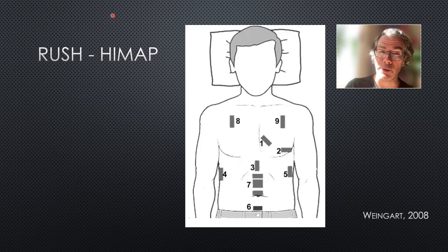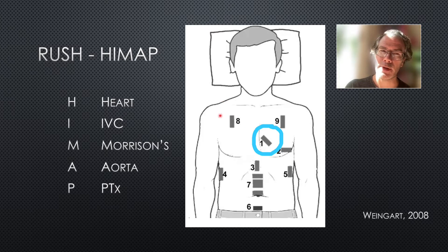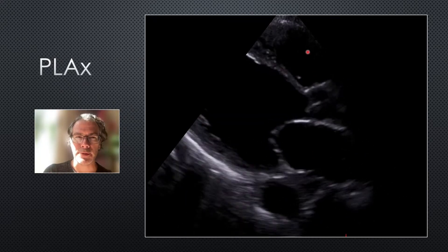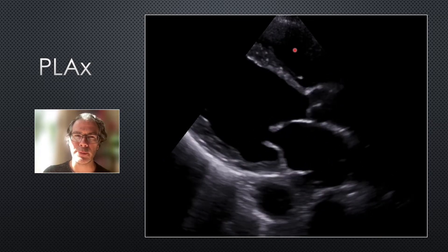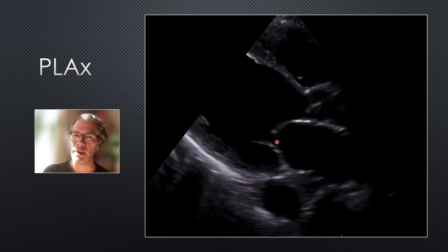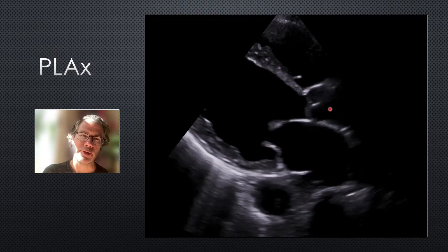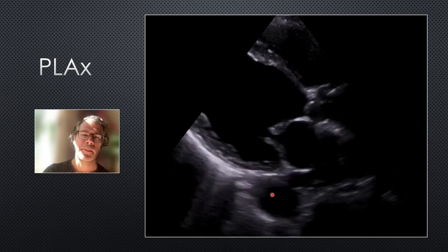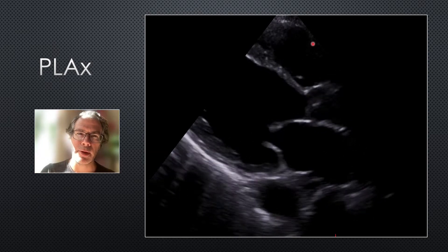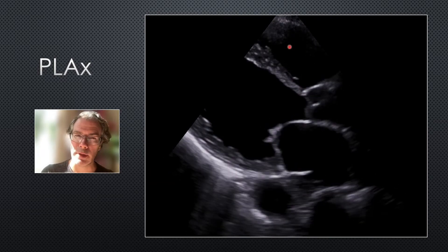We start the HIMAP exam with the heart. The first view is the parasternal long axis view — marker to the patient's right shoulder, probe across the heart in long axis. At the top of the screen closest to the probe we have the right ventricle. Blood goes from there to the lungs, then back to the left atrium, through the mitral valve into the left ventricle, and out the aortic valve into the ascending aorta and down through the descending aorta. There are three things we look for: pericardial fluid — can't see any; RV dilation — can't see any; and LV function.